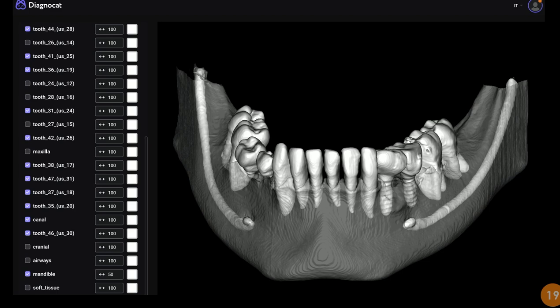I mentioned only one example, but there are many examples in this case. We can, for example, make a very reliable evaluation of the post-extraction site. After we remove the tooth, we know very well what we can find there, and we can use this tool as a valuable tool for starting our path, our journey to the guided implant surgery, for example.